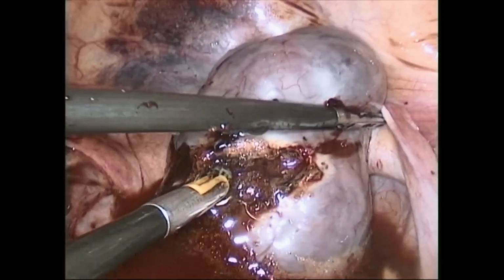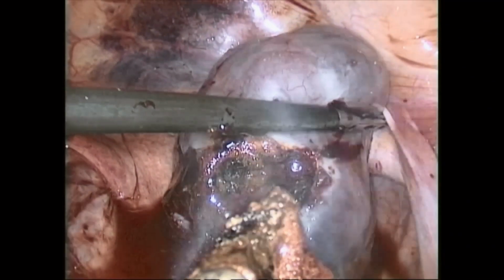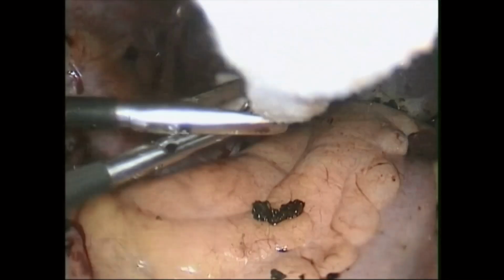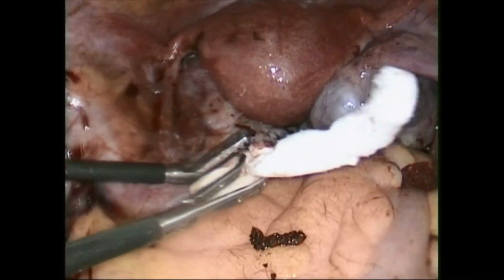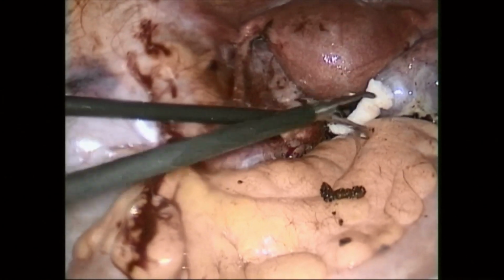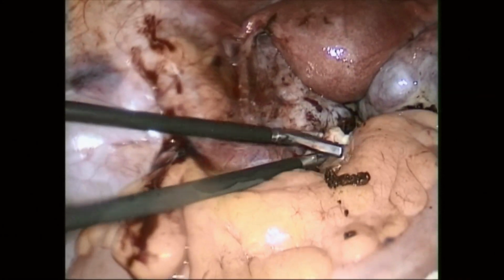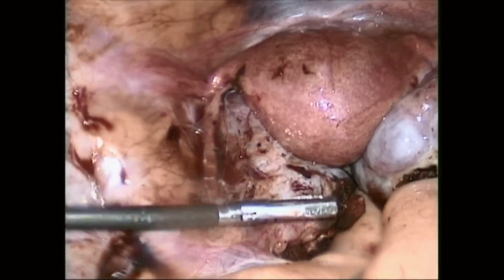This is the way it was done, and a thin crust of coagulated tissue was formed over it, and hemostasis was achieved. Then the Abgel is being put, and you can appreciate the end result, in which we were able to preserve both the ovaries. Later she delivered as well.